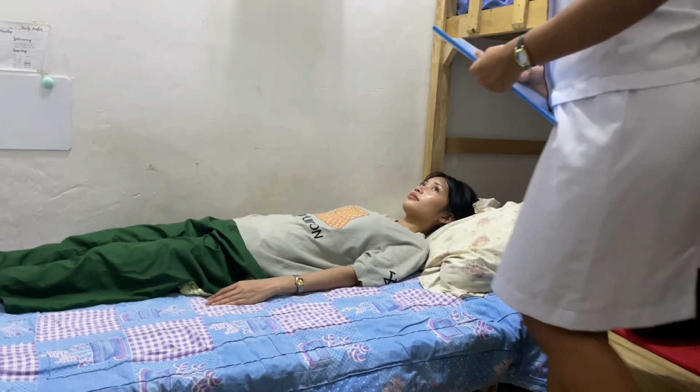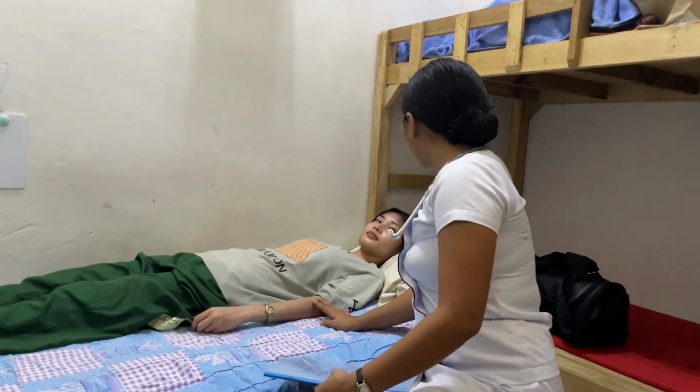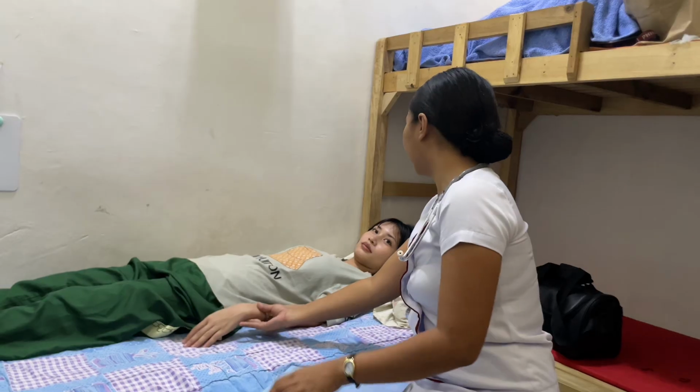Hello, ma'am. Good morning. How are you? I am Christine Joy Pastor, and I will be your nurse for today. May I know your name and your birth date? I'm Salvo. I was born on December 13, 2007.